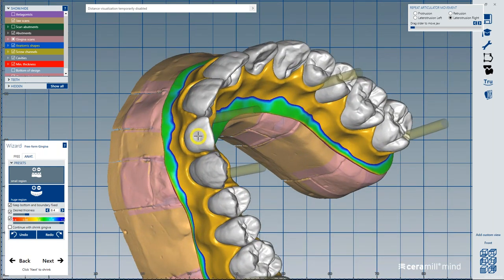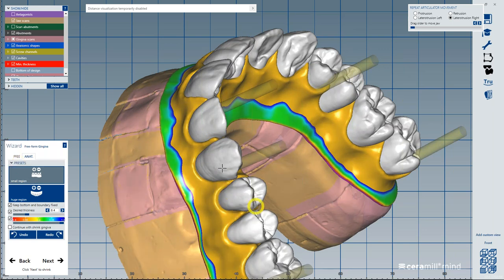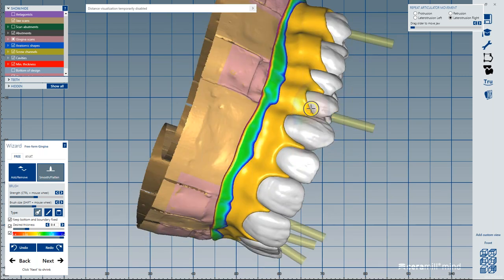So I'm going to show you a couple tricks. Either way, let's say you see this gingiva sticking out a little bit. I can go to a small region, grab that and tuck that in. Or you see this one is filled, but it's not smooth. So I can go to free and blend that in a little better. So here, if I hold shift, it has more of a flattening function, and you see just a couple clicks and that'll blend in a lot better.